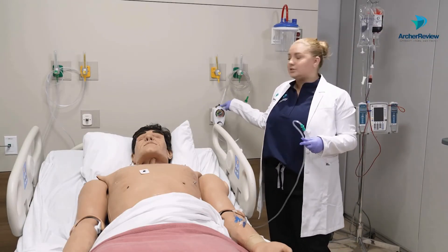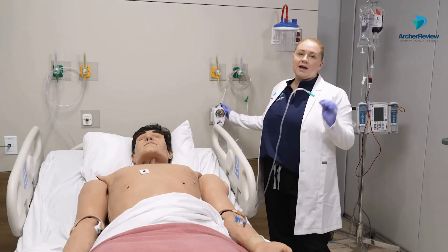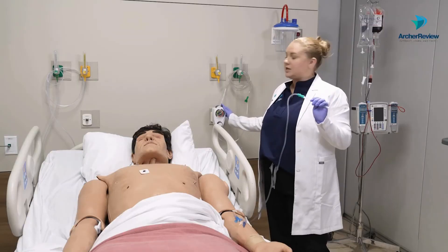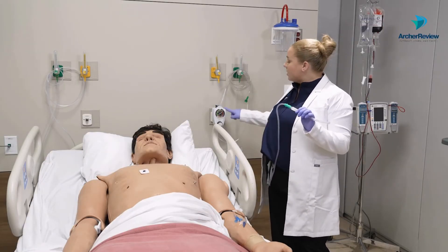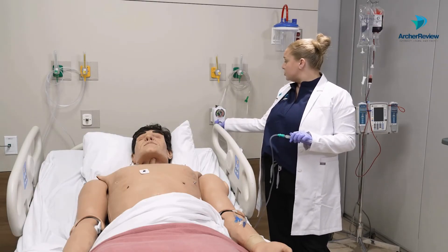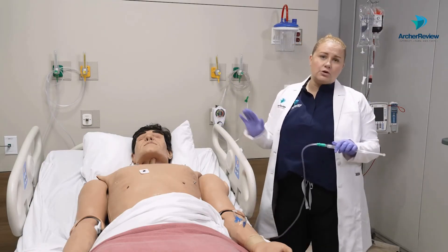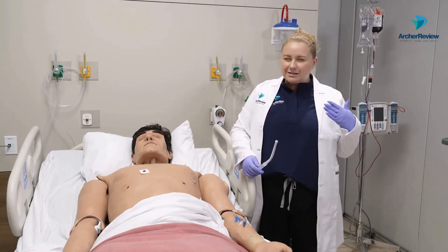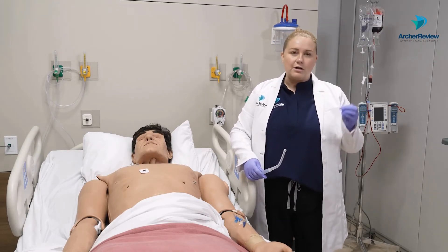We turn that suction on with this little wall device. In the top position it's off. Over here is intermittent suction, and for oral suctioning we want it over to the left on continuous suction. We'll then use the dial down here to turn that up, usually between 150 and 180 in adults — lower if they have any sort of trauma or sensitivity, or if they are a younger client.